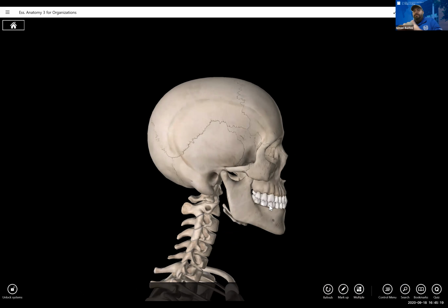Okay, so if I have my patient lying down in a lateral position, I'll show you like this. This positioning line, the IPL, needs to be perpendicular to the image receptor, which is sitting underneath the patient. I'm going to take out this background, that way you can see better. Okay, so here's my guy right here.